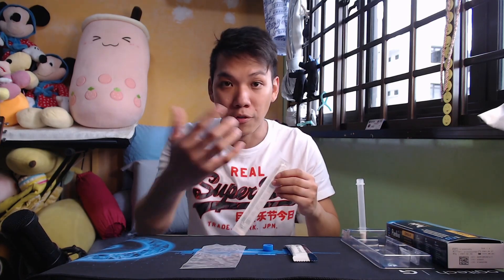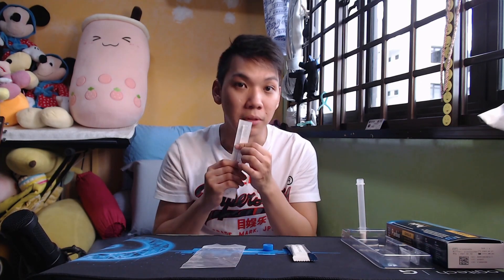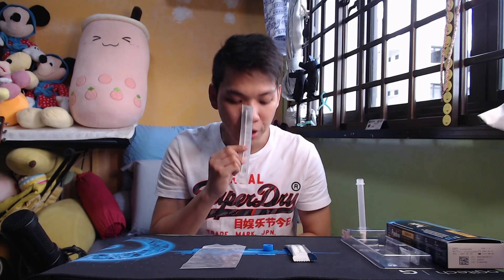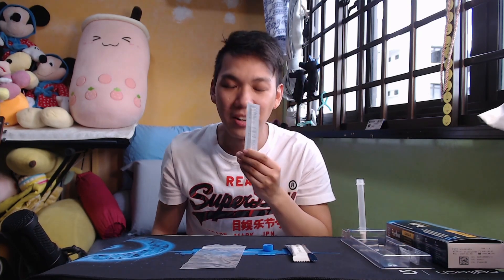Step four: stick it in. This is the uncomfortable part — it's not really painful, it's just more ticklish. I have a sensitive nose, so it's a bit annoying. What you do is stick it up two cm. When you stick it up and look in a mirror, make sure the entire cotton area is not visible, as it is inside. Then gently rotate the swab, rubbing the inside of your nose at least five times — one, two, three, four, five. Very important: do the other side of the nose as well, and repeat again — one, two, three, four, five.